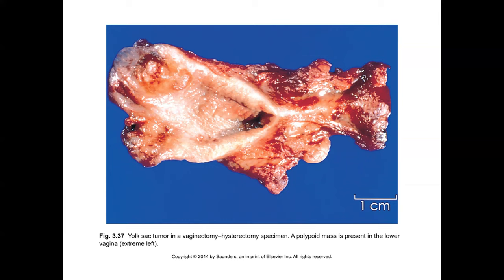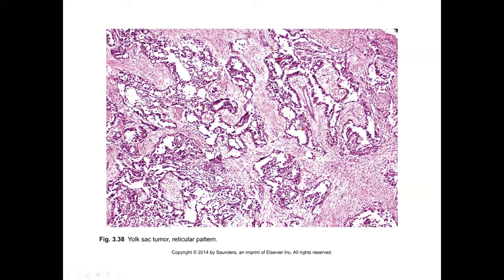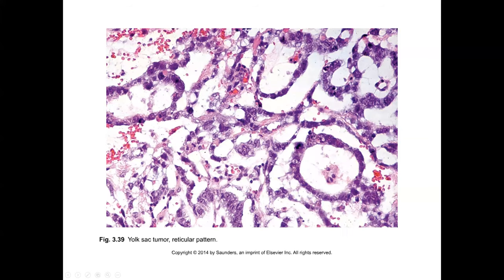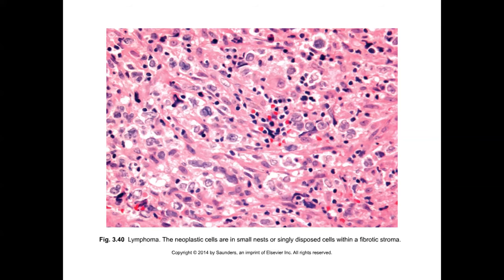Another pediatric tumor that can occur in the vagina is the yolk sac tumor. The morphologies are similar to those seen elsewhere in the gynecologic tract. The reticular pattern features varied cystic spaces with interlacing neoplastic cells bridging and lining those spaces. Characteristic hyaline droplets are typical of this tumor. The Schiller-Duval body does not have to be seen to make the diagnosis; immunohistochemical markers can help, and other variants may also be seen.